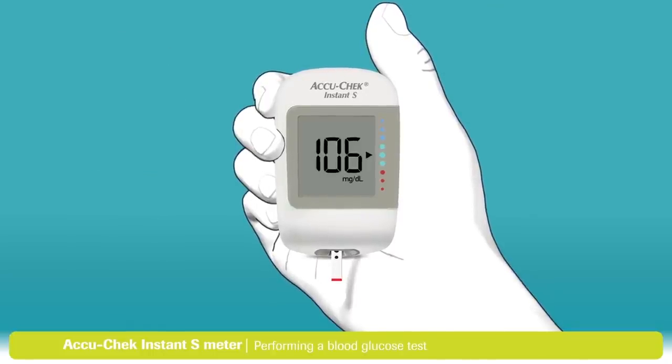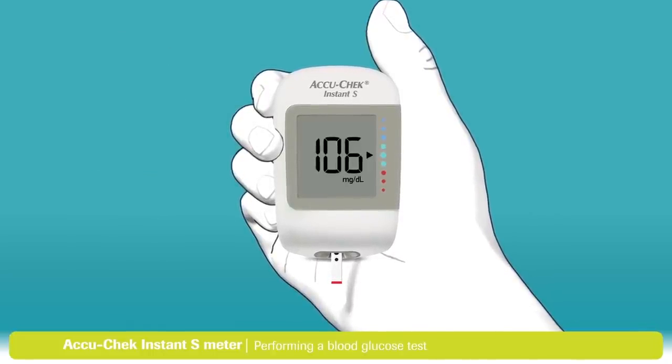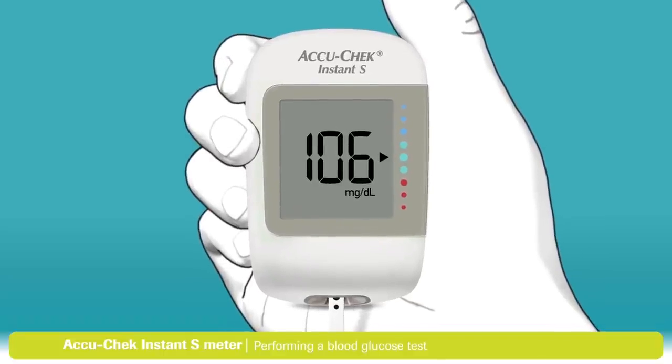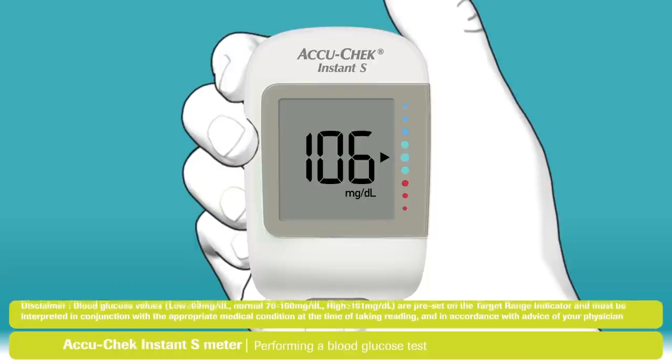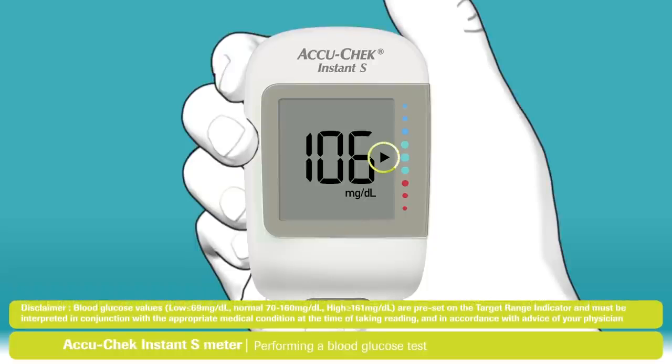When enough blood has filled the test strip, the flashing hourglass symbol appears. Your blood glucose result will be ready in less than 4 seconds. It's just that easy. And now you have your test result. When your test result appears, the arrow shows if your result falls above, within, or below the target range.